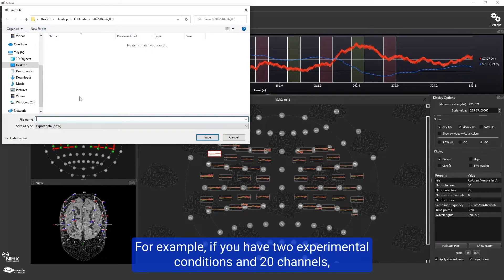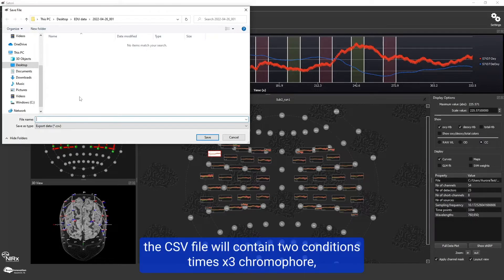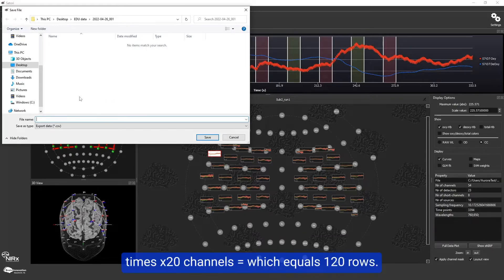For example, if you have two experimental conditions and 20 channels, the CSV file will contain two conditions times three chromophores times 20 channels, which equals 120 rows.